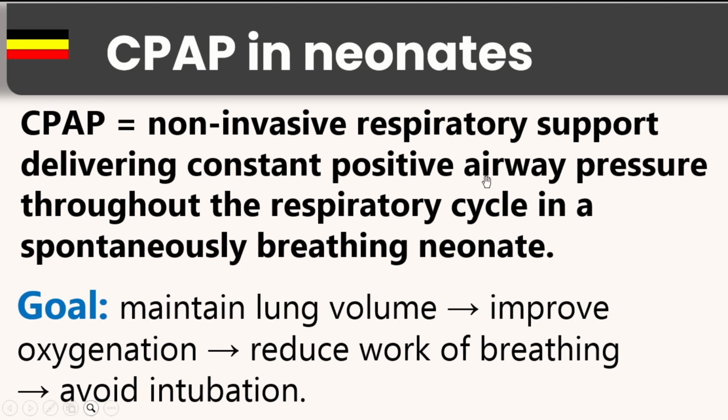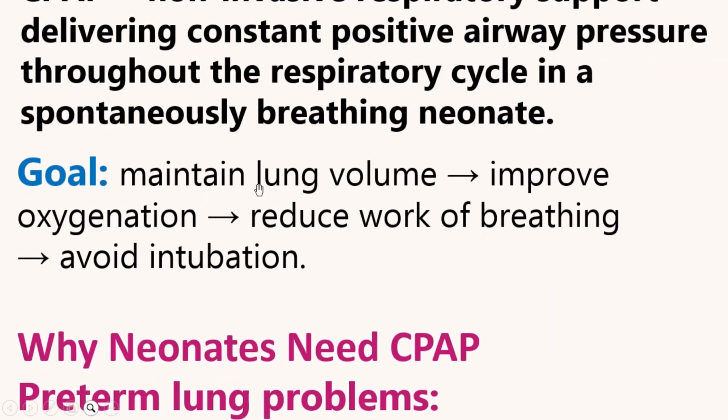So the positive airway pressure is very easy to understand. Imagine you're blowing into a balloon and then you deflate it. When you blow into that balloon, that is what happens during inspiration. And as you expire, all the air goes out. But if you leave a positive airway pressure, if you leave some air inside, which is what CPAP does, that balloon will not completely collapse. And the goal of that is that you want to maintain lung volume, improve oxygenation, and reduce the work of breathing.